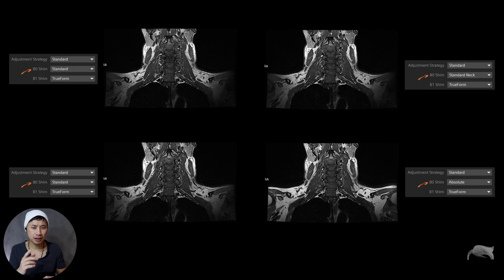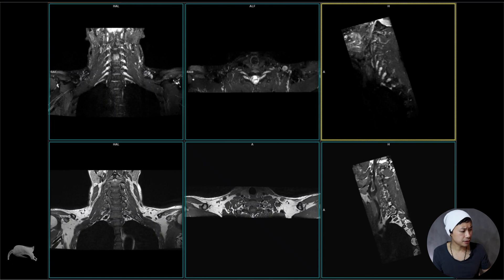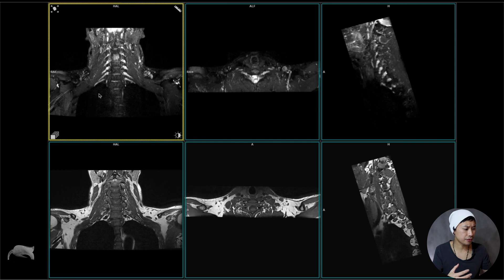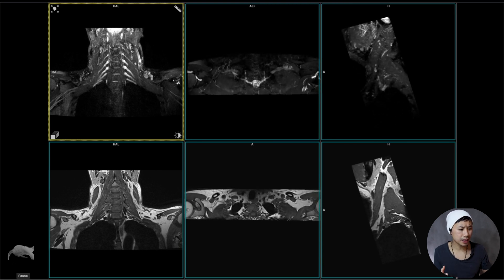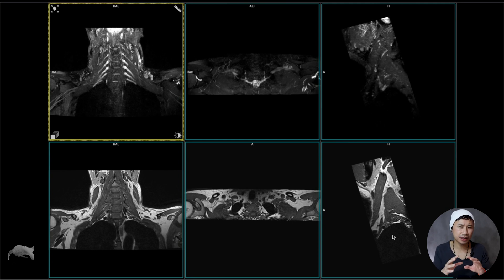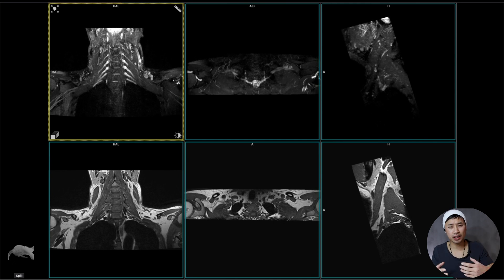Why do we need a sequence like this? In our brachial plexus protocol we have a 3D SPACE STIR where we visualize the nerves very well in all planes when it's isotropic. We want the corresponding T1-weighted volume in the same position so you can see the nerves and cross-reference them to a T1-weighted sequence in any plane — they're very well delineated. In our old protocol we had a 2D T1-weighted sequence, which had breathing artifacts and made it very difficult to see the nerves and vessels. Using 3D like this gives a much better chance of good images in all three planes. The pitfall is it takes a bit longer scan time compared to 2D, but if you can get images like this without doing rescans, it's worth it.